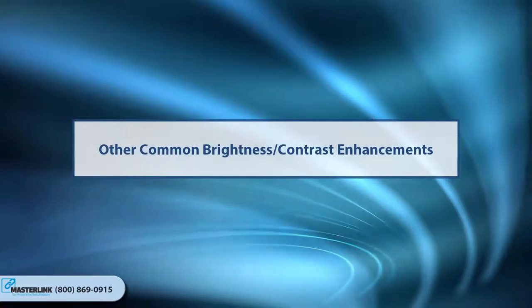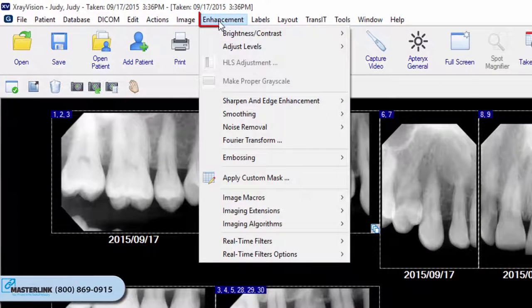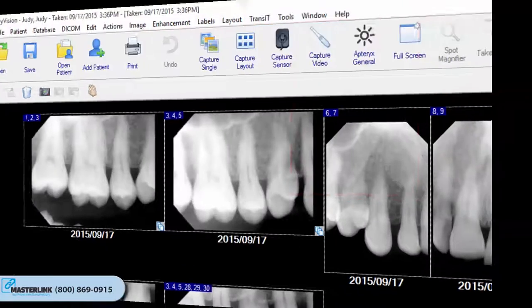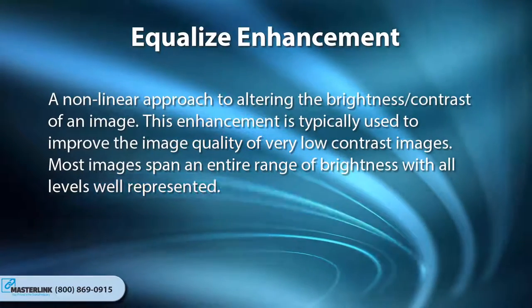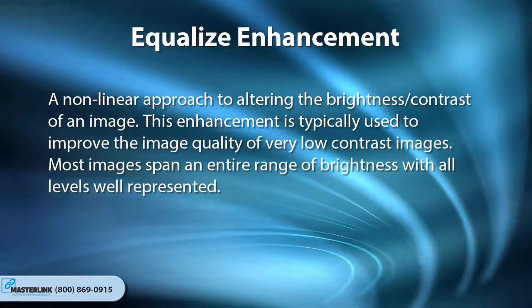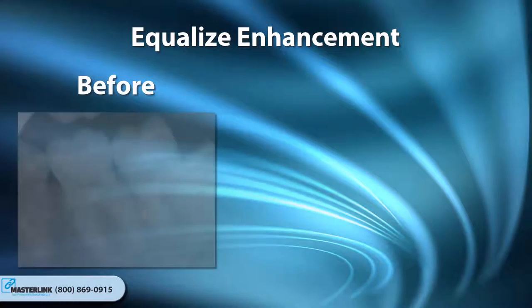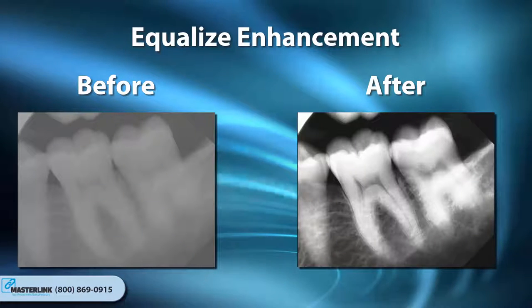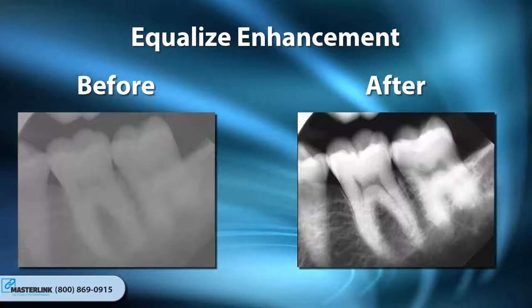Other Common Brightness Contrast Enhancements. The imaging application offers additional BC enhancements available on the main menu under Enhancements, Brightness Contrast. The Equalize Enhancement is a non-linear approach to altering the brightness contrast of an image, typically used to improve image quality of very low contrast images. Sometimes images are too light or too dark and some levels are overpopulated, leaving others underpopulated. The Equalize effect modifies an image so that all levels of brightness are equally well represented.